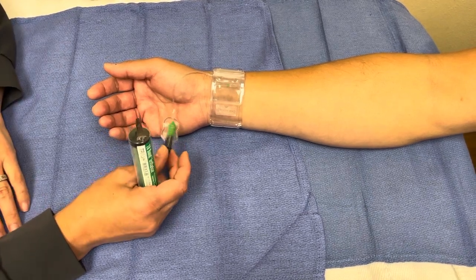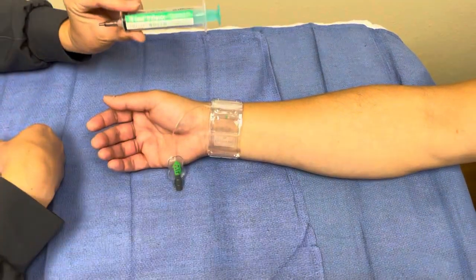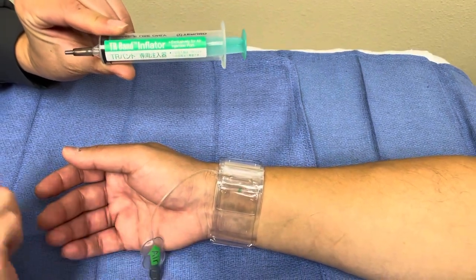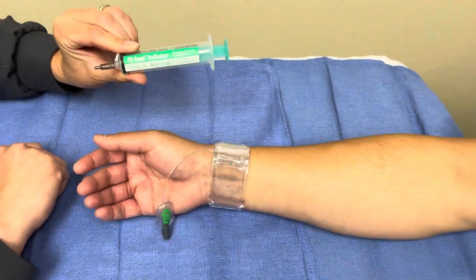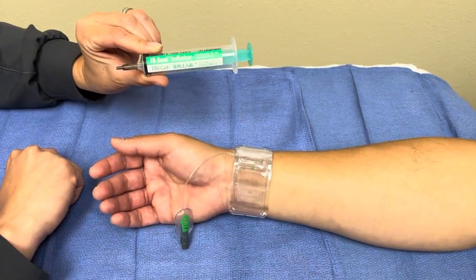Two things that are very important: make sure that we have the correct syringe. This syringe is special for this band. If you do not have this syringe, you need to call us, because you will not be able to just use any syringe. It has to be this TR band syringe that goes with the band.